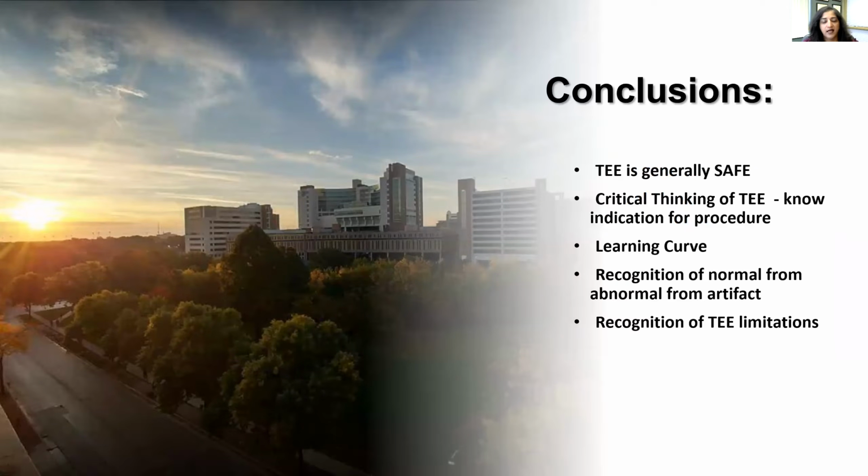In conclusion, TEE is generally a very safe procedure. It's really all about critical thinking and knowing the indication of the procedure. Unlike TTE, you don't have the ability to go back and take more images, so you really need to have all the information that you need before you withdraw the TEE transducer. There's definitely a learning curve with TEE. The more you do it, the more you build confidence.